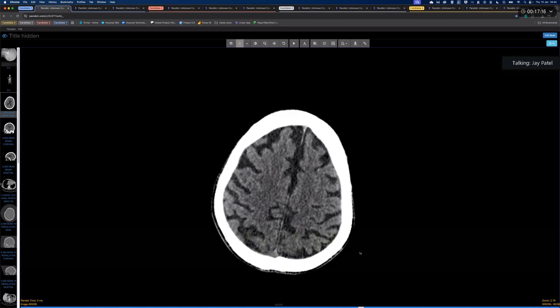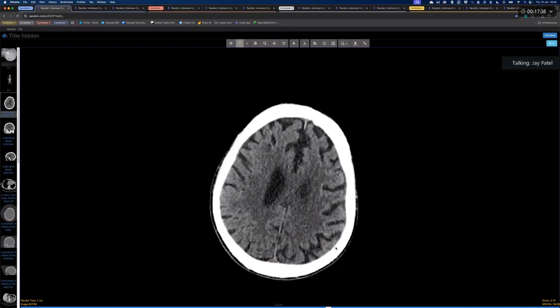So if you can see a cortical stripe overlying the edema, you can be more sure of it being vasogenic and more likely then to be something like a metastasis, something inherently different to the brain tissue that shouldn't be there, unlike something like an infarct or multiple sclerosis.